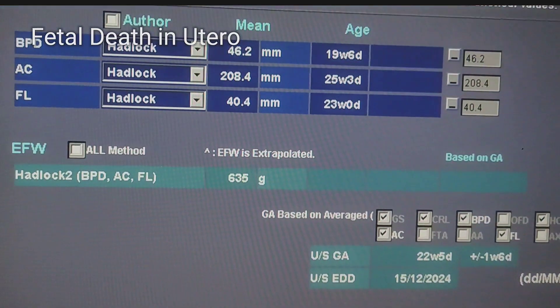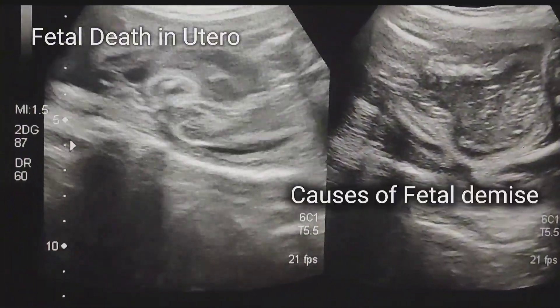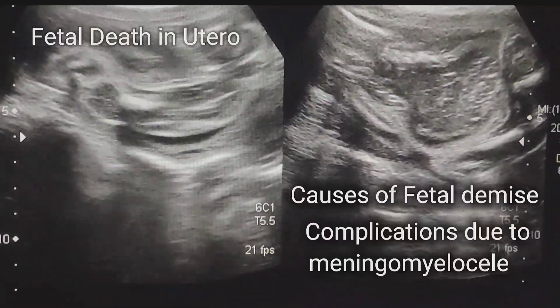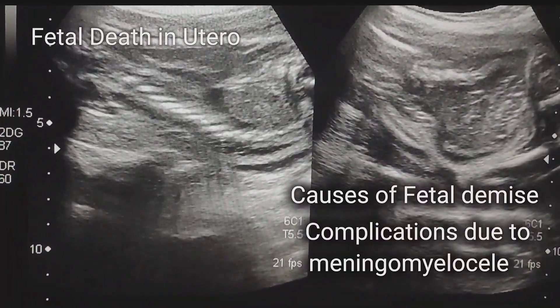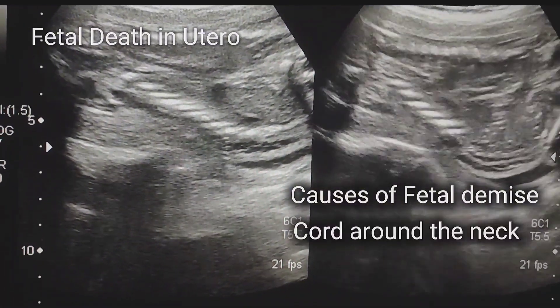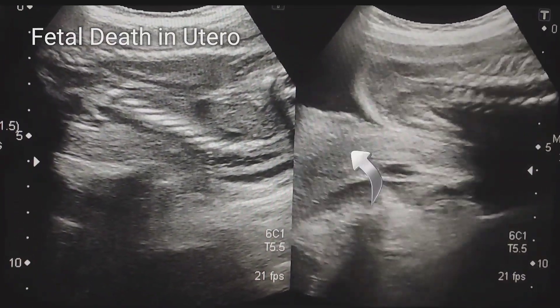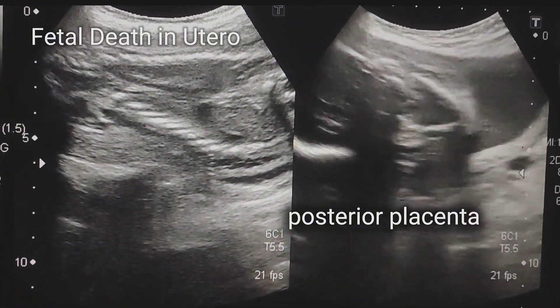Marked discrepancy of fetal biometry is seen. Assessing this case, the causes of intrauterine demise may be complications due to meningomyelocele, which may include infection, inflammation, or severe neurological impairment. Cord around the neck may have caused restriction of blood flow to the fetus, leading to fetal distress. The placenta is seen to be placed posteriorly.